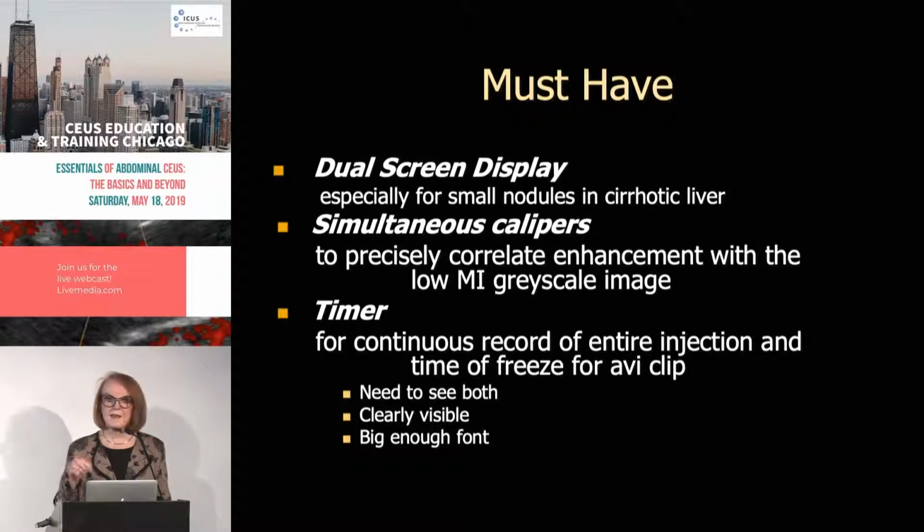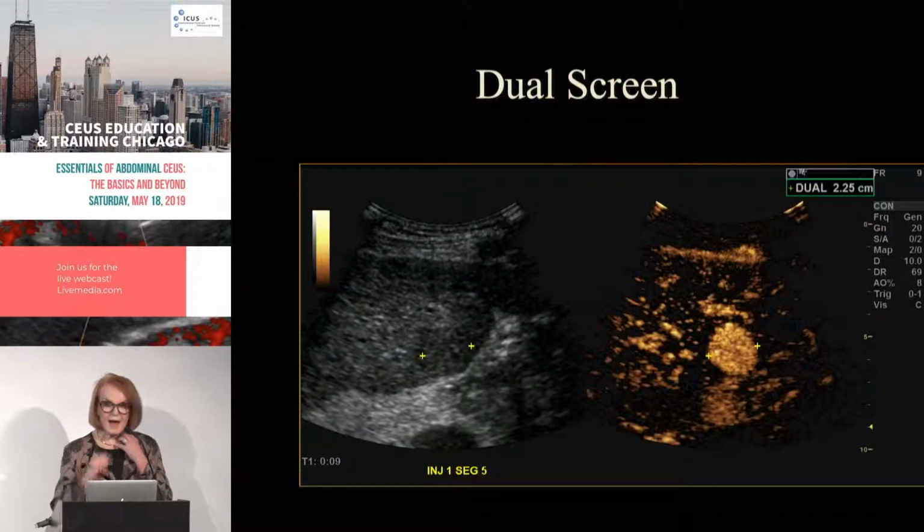So we're not going to say this happened in the arterial phase. We're going to say at so many seconds we saw arterial hyperenhancement, and at such an interval, 90 seconds, 2 minutes, or whatever it is, we saw washout. And this is because these time intervals are specifically discriminatory as compared to the more general ones we have on CT and MR.